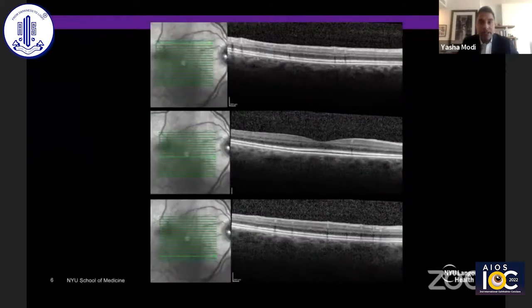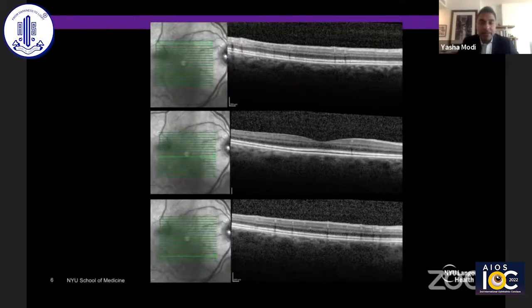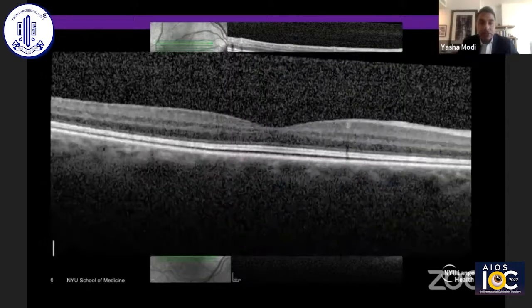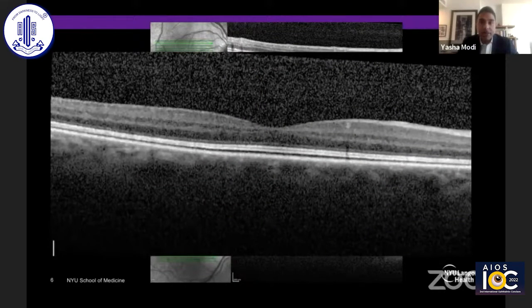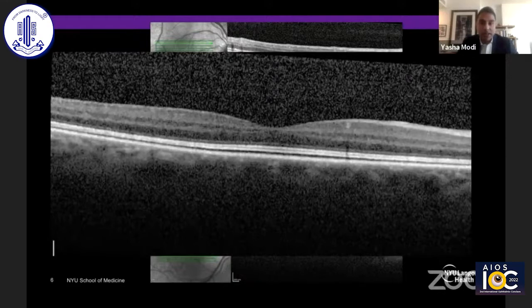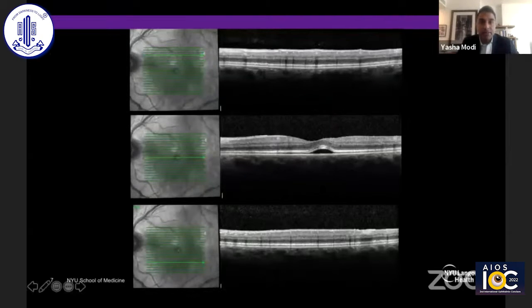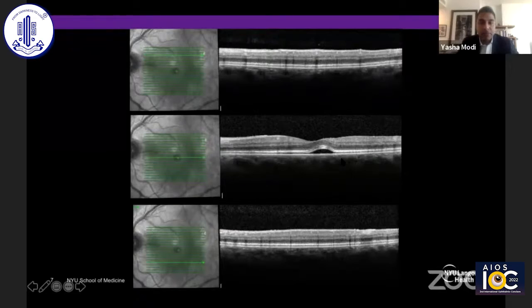Going through the scans — this is the right eye, both superior to and inferior to the fovea — we can see that there is this uniform IZ-RPE separation throughout the entirety of the macular cube. This is a close-up to really highlight the fact that this is not an artifact, but rather a true splitting between the IZ and the RPE. In the left eye, we see very similar findings, but the EZ is much more thickened and that bleb of fluid is developing.